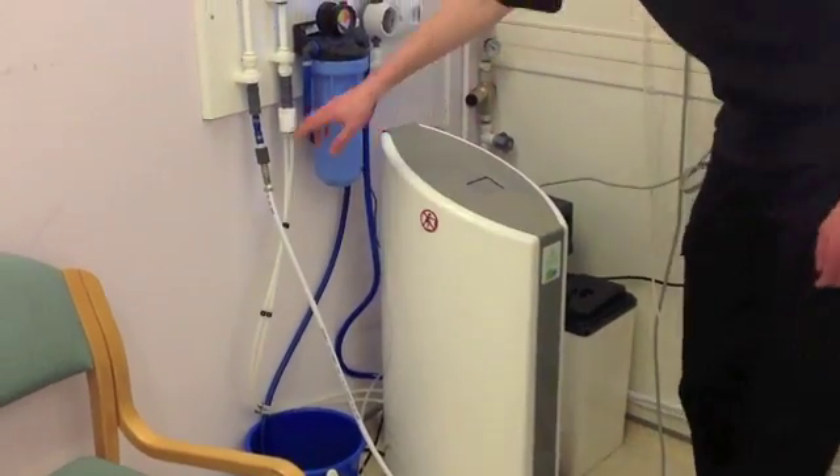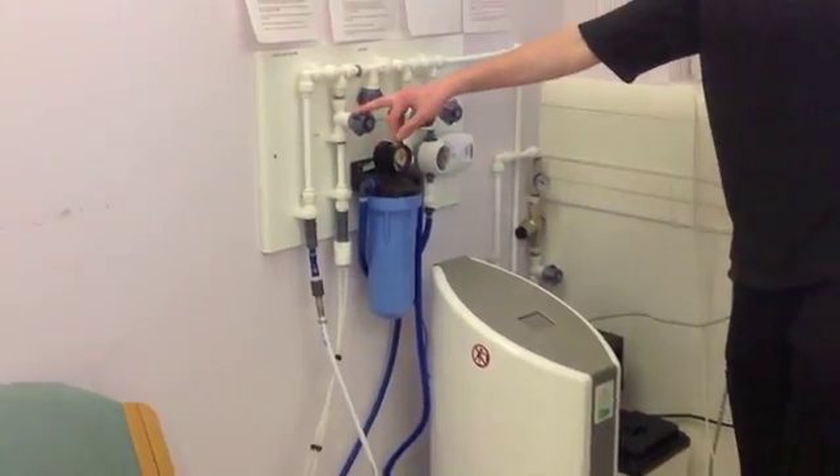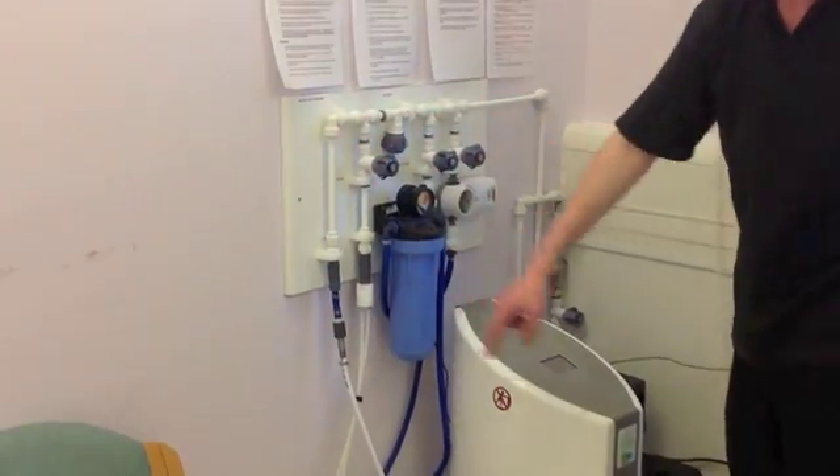And then that water is put to the RO which will take out any more impurities. The RO will then pass the water up to this valve which you will then turn on, and that will then go to your dialysis machine.